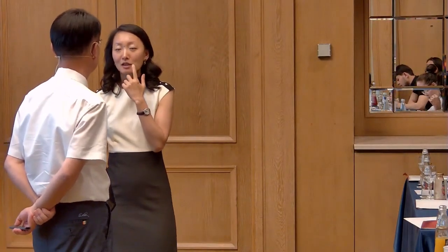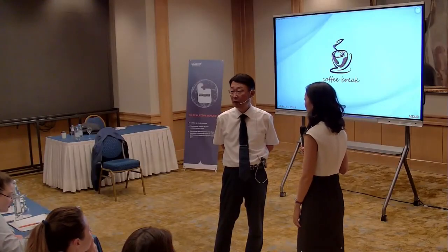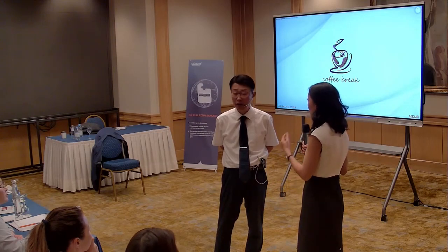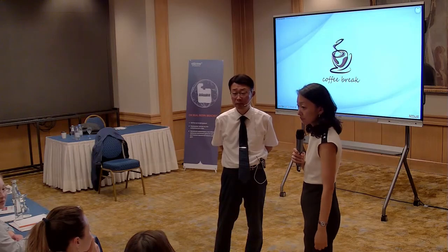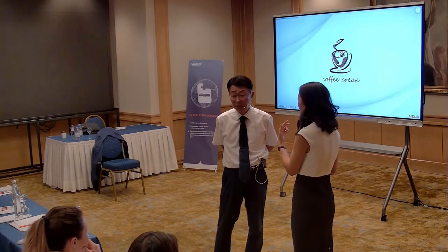Question. How long should we retain with mini screws and ligature wire? Low incisors. More than 6 months. More than 6 months? Yeah, with ligature wire, after finishing intrusion. Mini screw with ligature wire, 6 months.